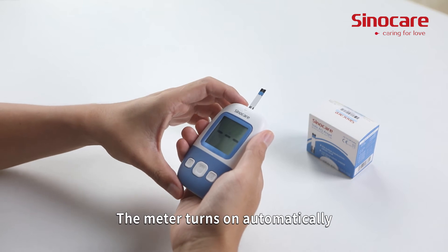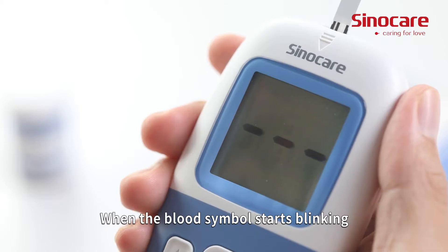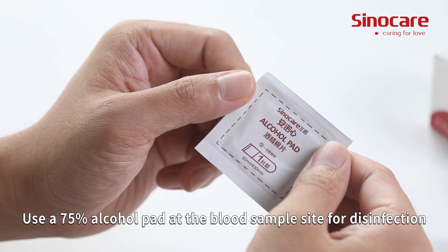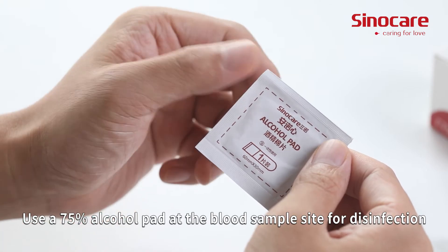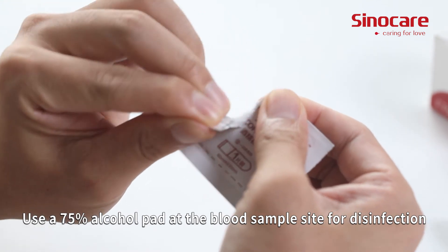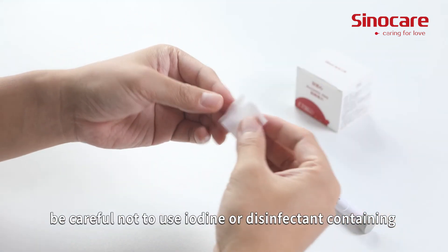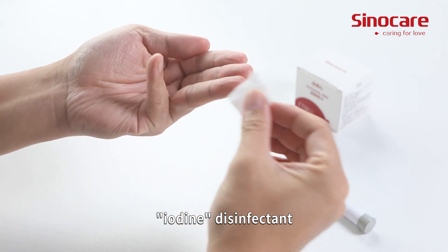The meter turns on automatically. When the blood symbol starts blinking, the meter is ready to use. Use a 75% alcohol pad at the blood sample site for disinfection.